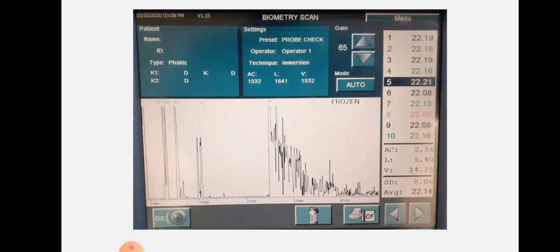time. Depending on that time, the distance of the eyeball is measured by a formula: distance is equal to velocity into time. So how much time it takes to travel through the ocular structure is multiplied by the velocity. By this method, the distance covered is measured.